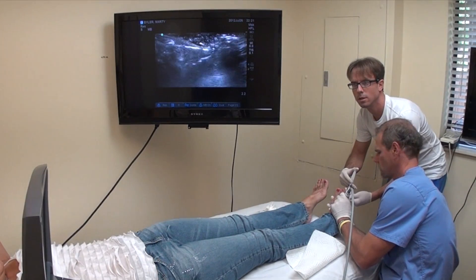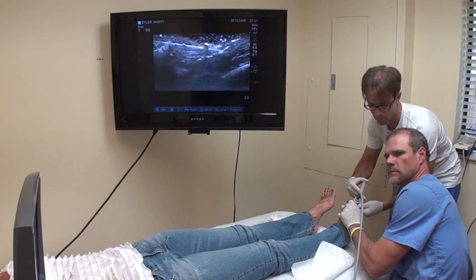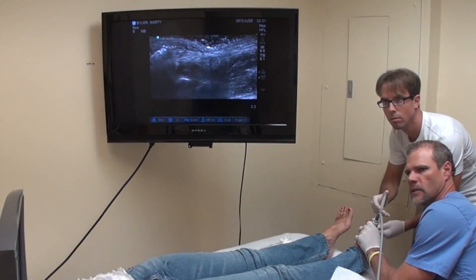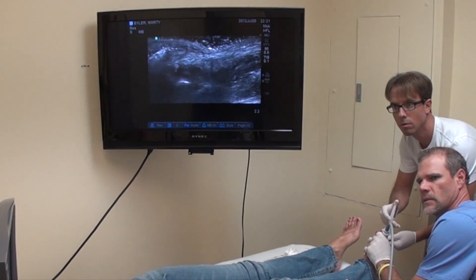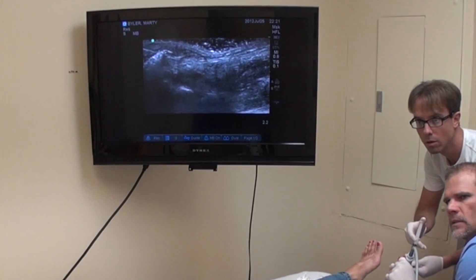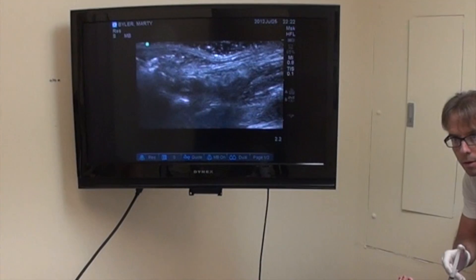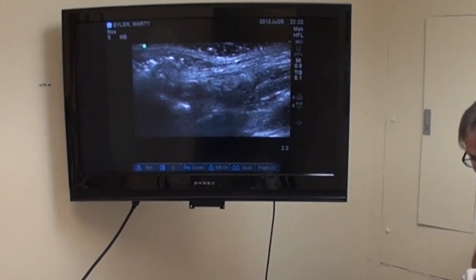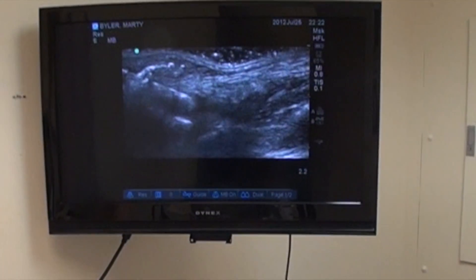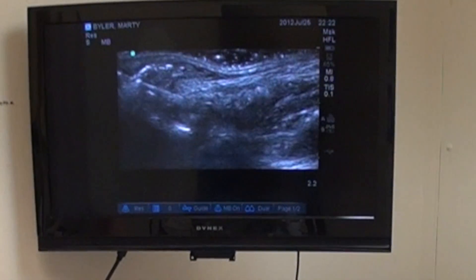Morton's neuroma is generally from an adhesion and an entrapment from the second and third metatarsal head. There are foot issues that need to be considered, which is why I recommended orthotics for this patient. The adhesions, scar tissue, and interference to that nerve can be released with this procedure. Surgery for Morton's neuroma is absolutely not necessary. With new innovative procedures like this, we're able to easily and quickly handle these. In the ultrasound above, you can see the needle approaching from the left, and the neuroma is being injected with the solution releasing those adhesions.